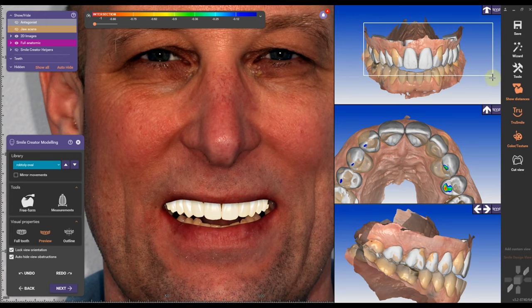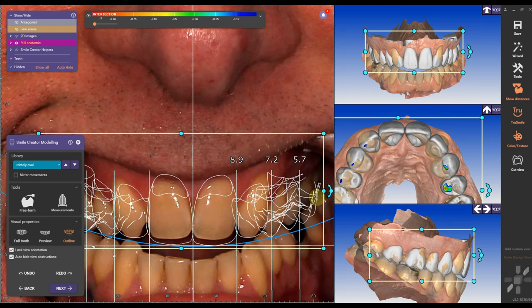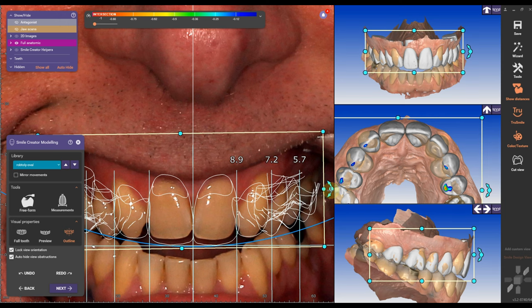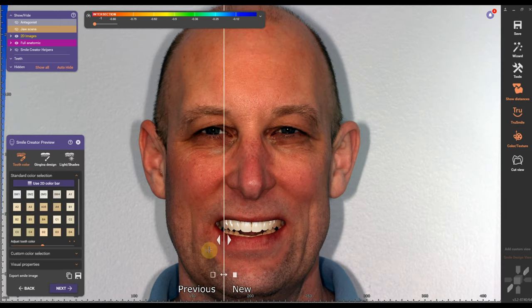What I notice right away in the smile window is that my smile is a little bit canted. So I'm going to rotate the entire teeth arrangement and make it even with my horizontal line. That will even out the smile and it looks much better.